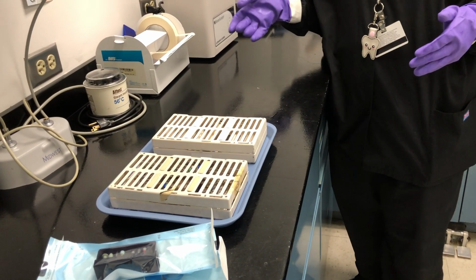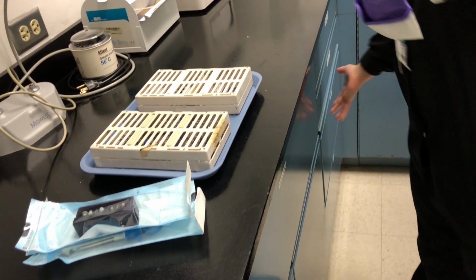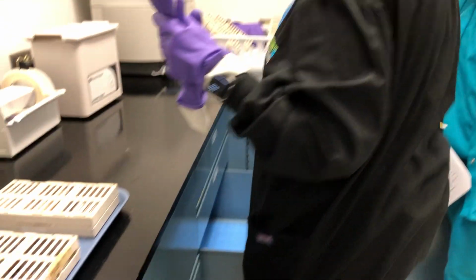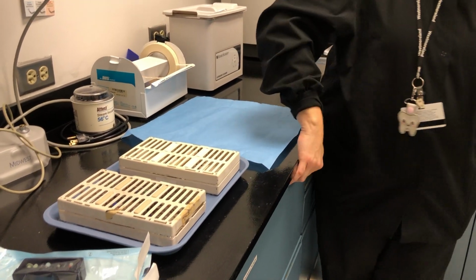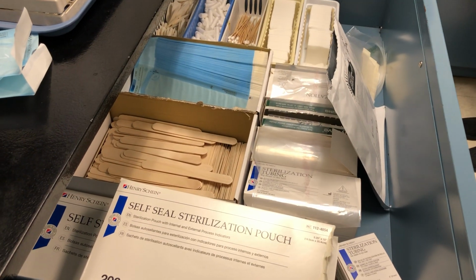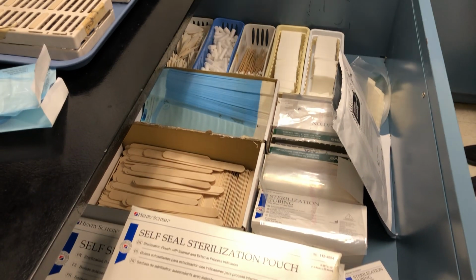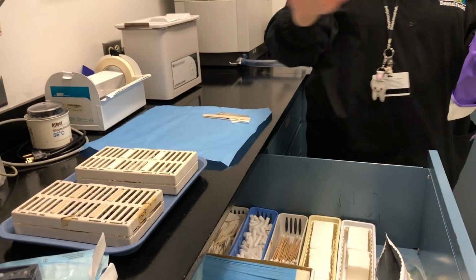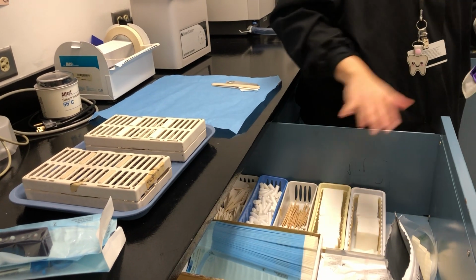But we're going to use IMS wrap, and those that have helped me wrap, you know how to do this already. But the IMS wrap is down here in this drawer, and you'll see we'll be working with pretty wrinkly things just because we're reusing. But we put the IMS wrap down. Then we also can get our disposables from this drawer. Take our glove off. We're going to do gauze. We're going to do cotton tip applicator, tongue blade, and for practice we can use one of the integrators so you guys get on to putting all those things in, okay? So they're all in here and we'll help you. The little integrators are in this bag and then everything else is visible.